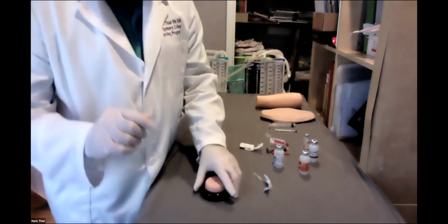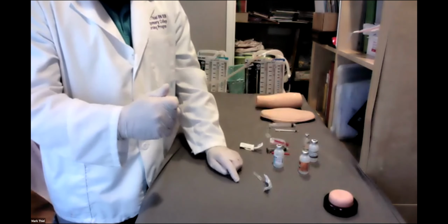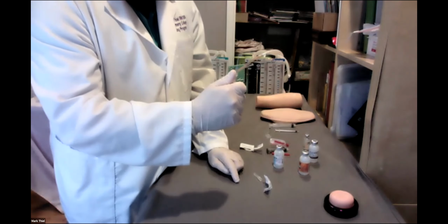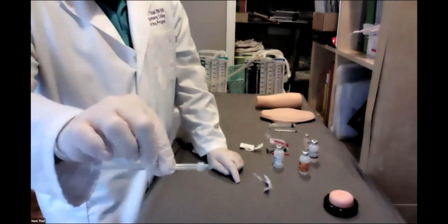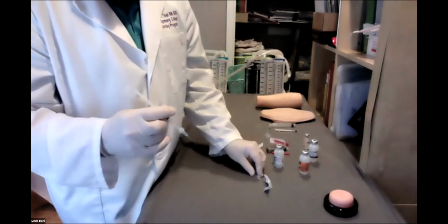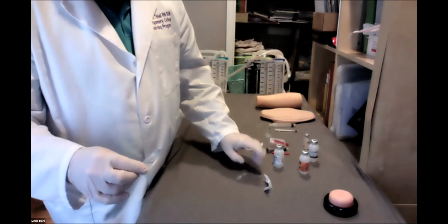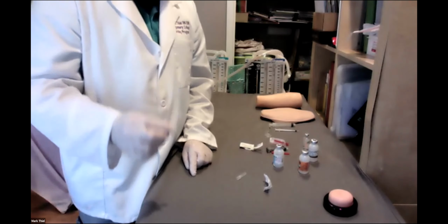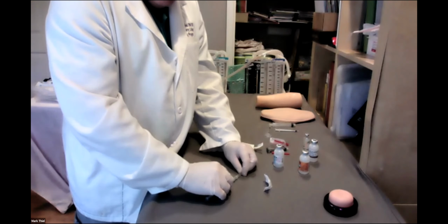Withdraw, release the Z. And again, what I don't have on my traditional old needle is a safety guard. You will flick your safety guard and both go into the sharps together. Have you ever had the chance, or whatever, to recap for some reason the scoop?